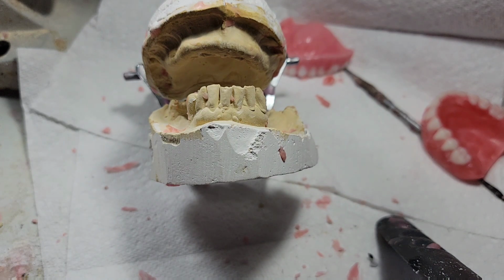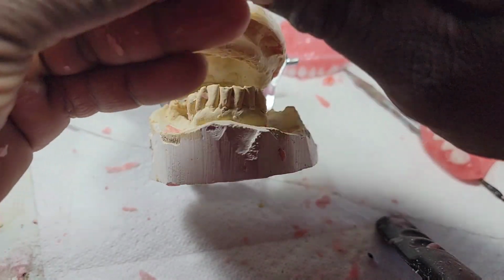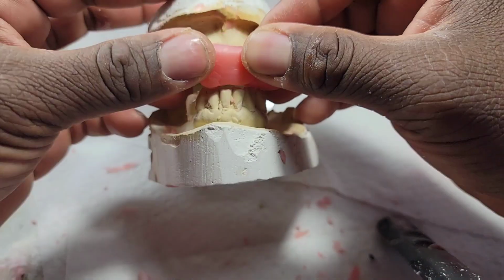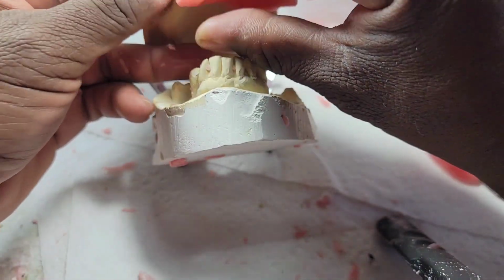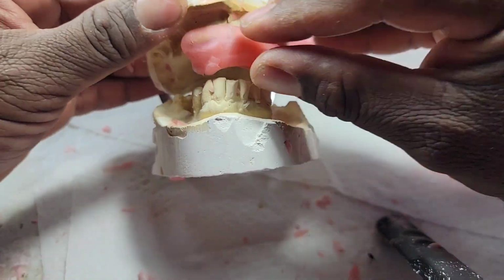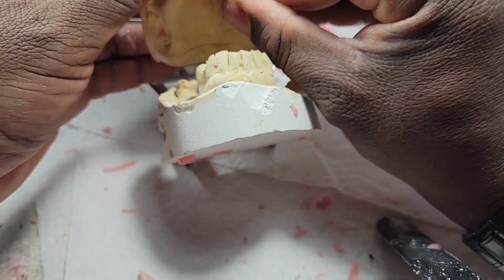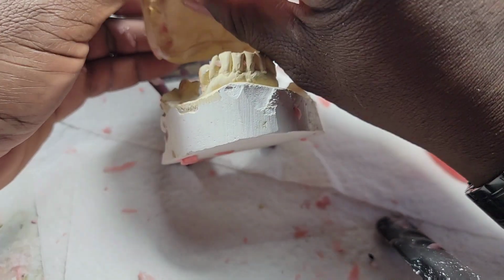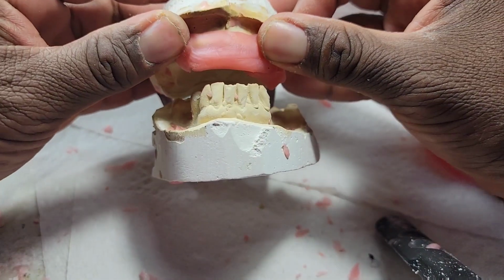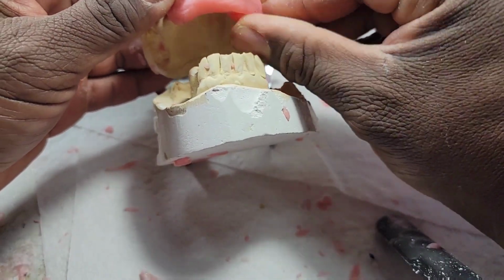I have to build it up and create that extra weight on the denture. This is how much I have to add to the distance between the top and the lower in order to put teeth here. See? That's what happens when you add, when she wants that denture to be seen.